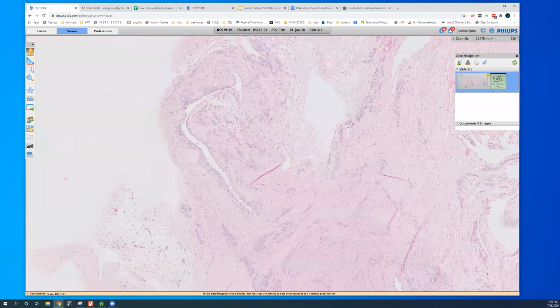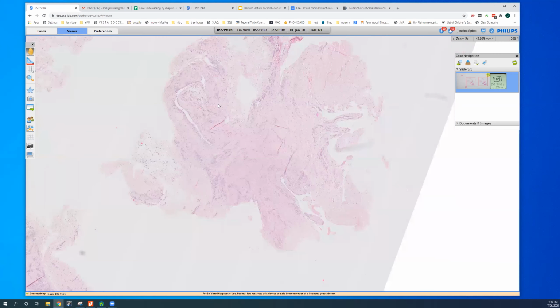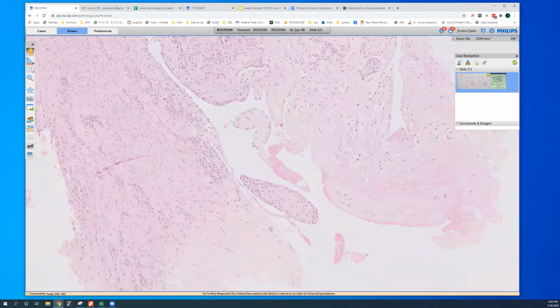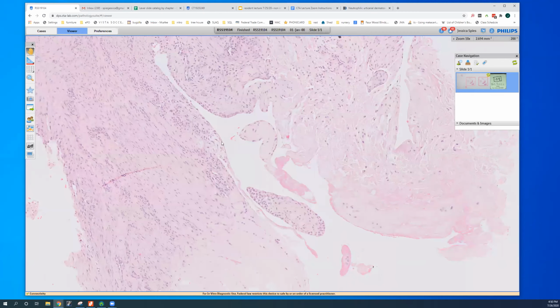It's got something down here in this other fragment in the biopsy, which looks like soft tissue. It doesn't look like we're in the dermis anymore. We don't really have any adnexal structures. So what if I said we're near a joint? And when you biopsy this, some myxoid material came out. Exactly, digital mucous cyst.